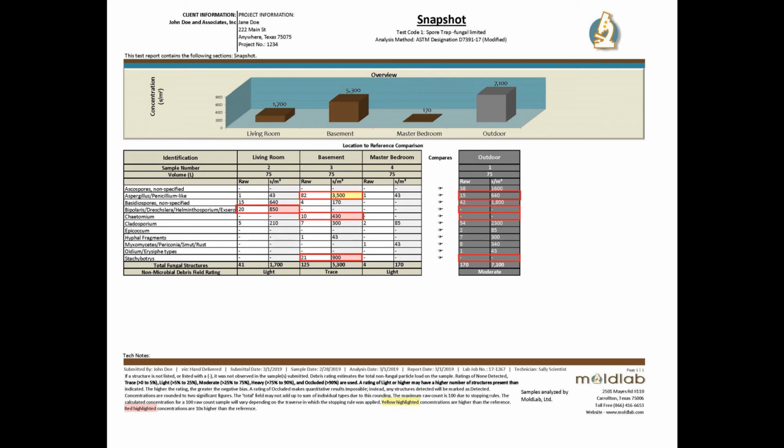It is generally preferable to compare the concentrations rather than the raw counts, as the concentration takes into account differences between microscopes, cassettes, and sampling times. If two samples were run for different lengths of time, it is completely impossible to compare them using the raw counts, and you must use the concentration. If they were run for the same period of time, it may be possible to compare the raw counts between the samples, but it is still not recommended.